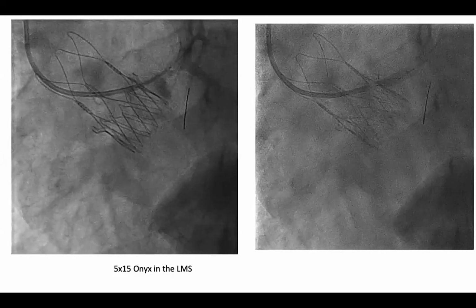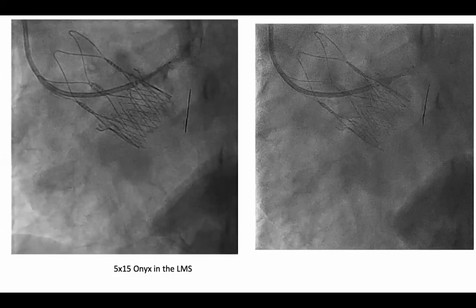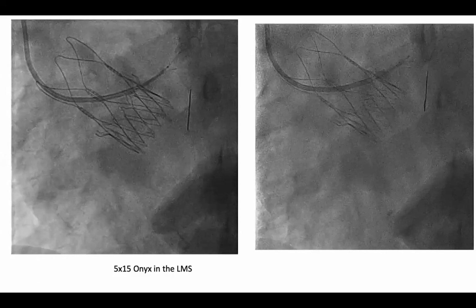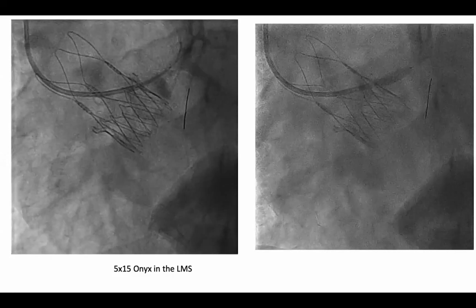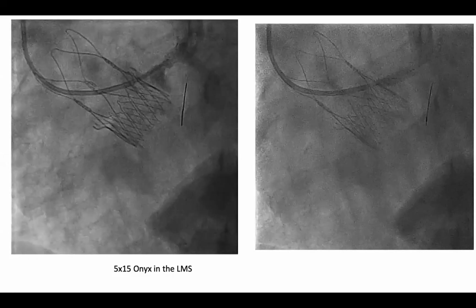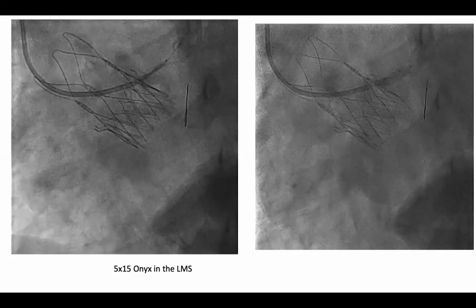But what was the reference diameter in your mind, what should be the left main stem diameter if there was no post-stenotic dilatation? So I don't have that still picture from the proximal left main, but even the proximal left main, which is not ectatic, the reference diameter was 9 millimeter plus. Yeah, at the ostium, I accept that it will be quite big. But fair enough. Okay, let's see how we go.